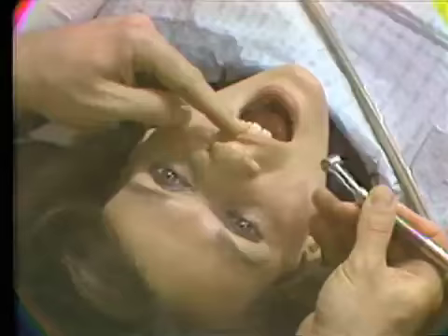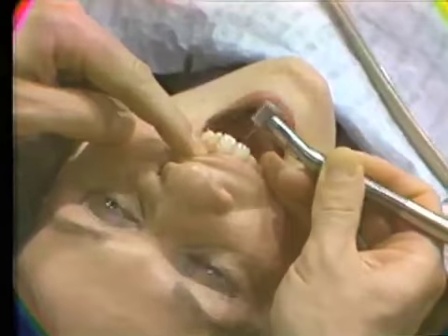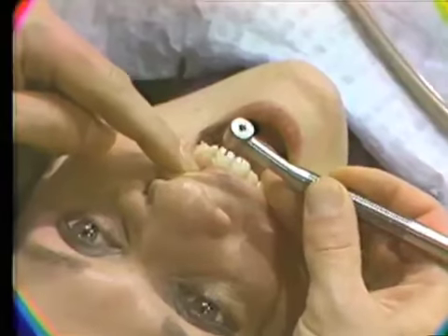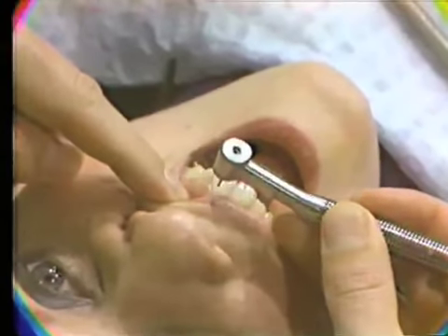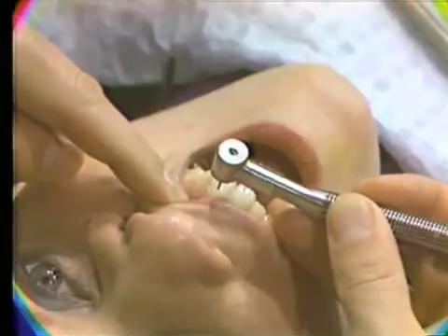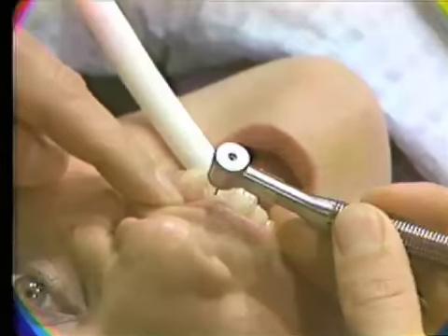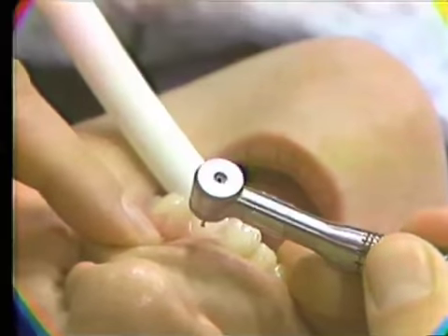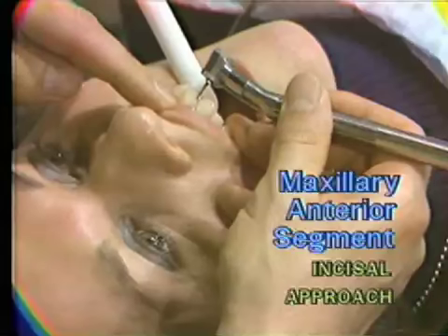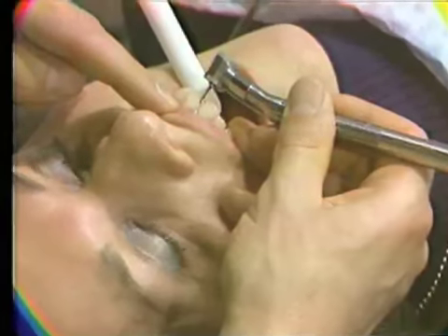Retraction is accomplished with the operator's left index finger. A stable finger rest can be established on either the incisal edges of the right anterior teeth or the occlusal surfaces of the maxillary right bicuspids, depending on the area being treated. The evacuator tip is placed to the lingual of the tooth being treated, with 1/2 of the opening placed beyond the incisal edge. This approach is often required for crown preparations and Class 4 restorations.